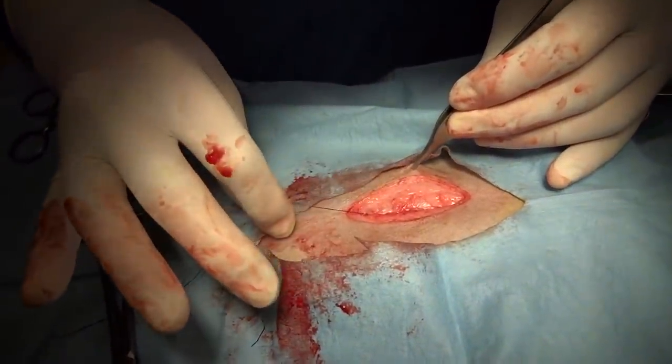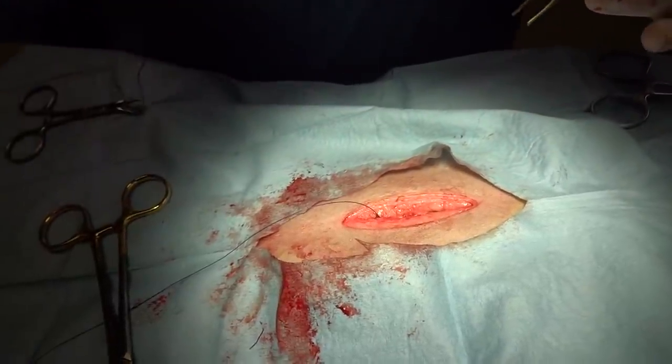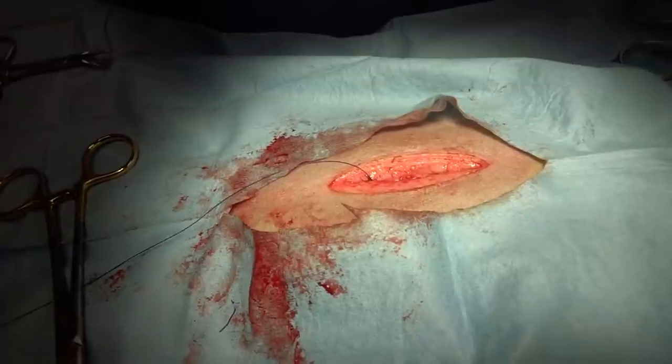Here is the incision we've just started to close. We're going to close the body wall, then do the subcutaneous layer, and then we will do the skin.